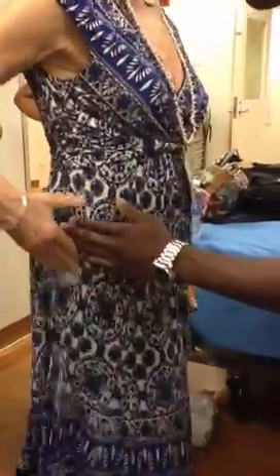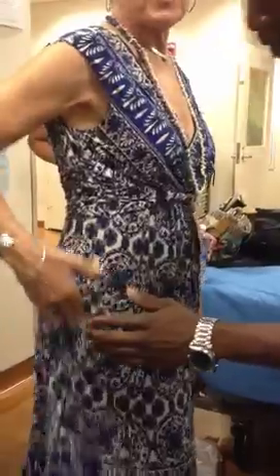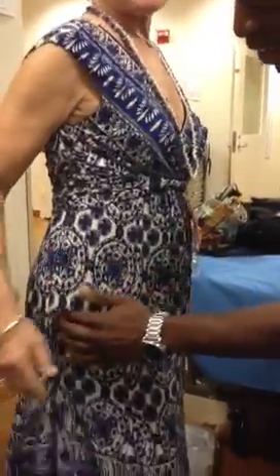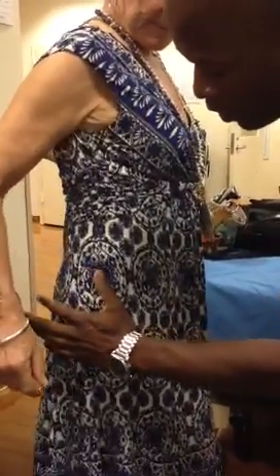Yeah, you have to touch people. And that's one thing, you're going to be touching a lot of boobs, vaginas, everything. So you just have to get used to touching, okay? So you're bending your leg. Because you're not a visitor, you're a nurse. There's your trochanter.